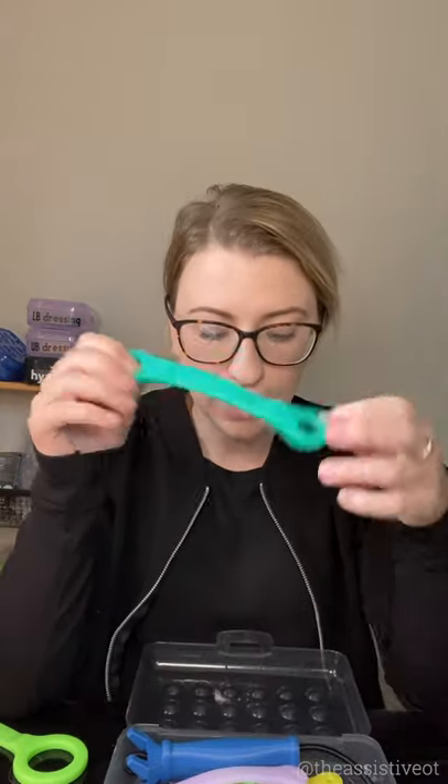Easy Holds are essentially a universal cuff — they're silicone and come in a bunch of different sizes and colors. If your child has problems holding a button hook, you can put the Easy Hold right over the button hook and just slip it on. Depending on their hand strength, they could then use the pull part to pull that zipper.